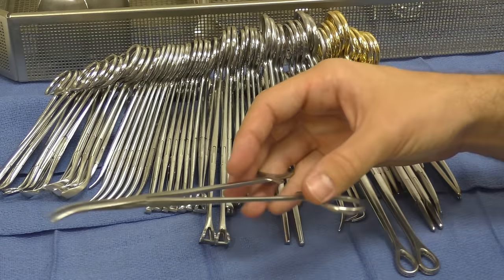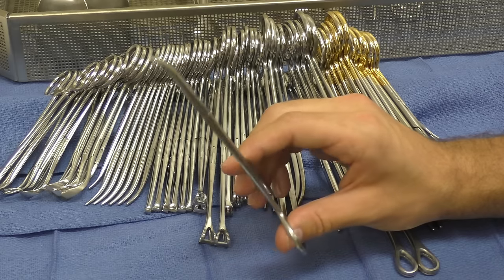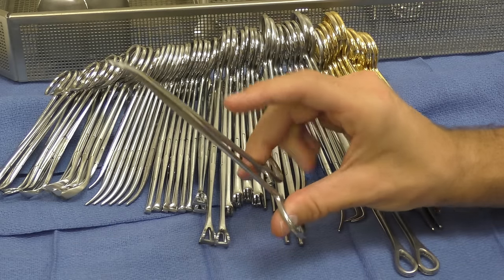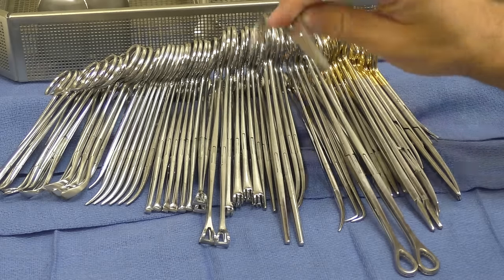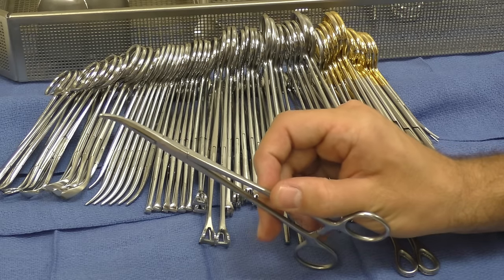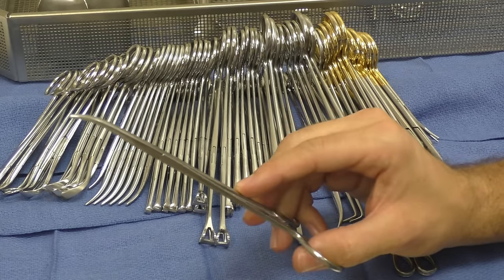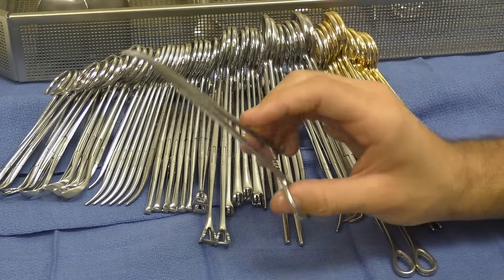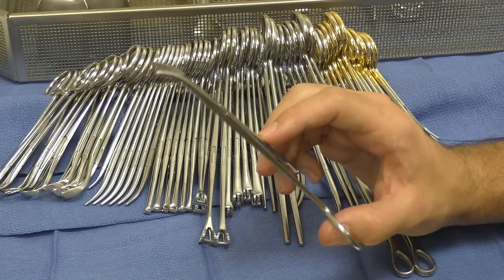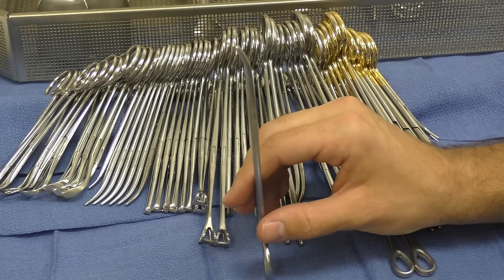Next up is the tonsil, also called the schnitt. Yes, it's not a bad word, it's the schnitt. This tonsil clamp is used for dissection quite often actually, and this length of the tonsil, I believe it's an 8-inch length, is the most common length that you will see for this tonsil. A lot of the times, if the surgeon wants a tie on a pass, you will put the tie on a tonsil clamp for them to use for the tie on the pass. Other times they may ask for maybe a peanut, and this tonsil sponge will be used to hold that peanut. This is a good general use item for those types of things.